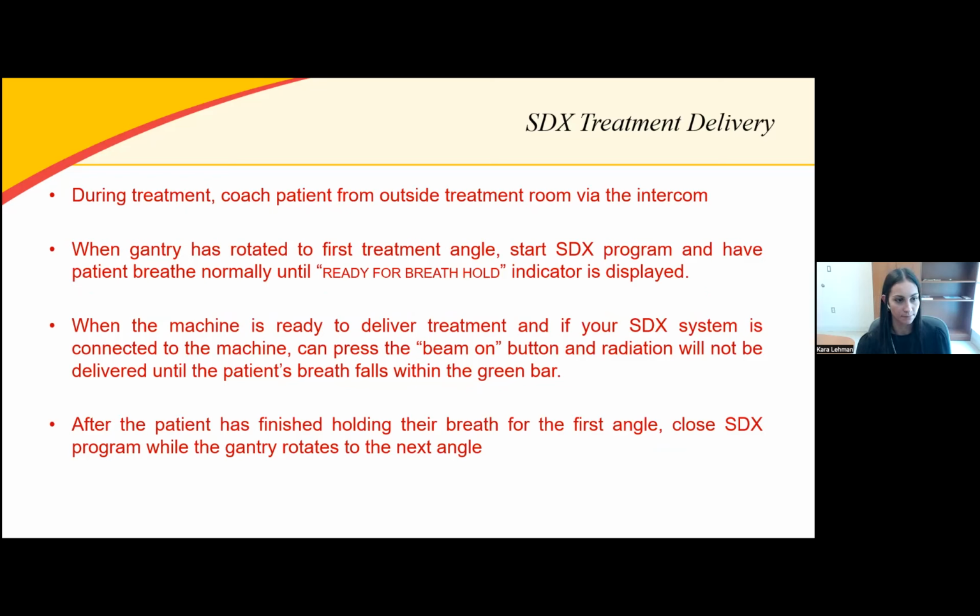This is the part where, at our center, we actually have our SDX system linked to our treatment delivery system. So this part is actually automatic for us. When the machine is ready to deliver treatment and we have requested our beam and have our beam ready to treat, we go ahead and press beam on, and the radiation actually does not start until the patient holds their breath within the appropriate margin.